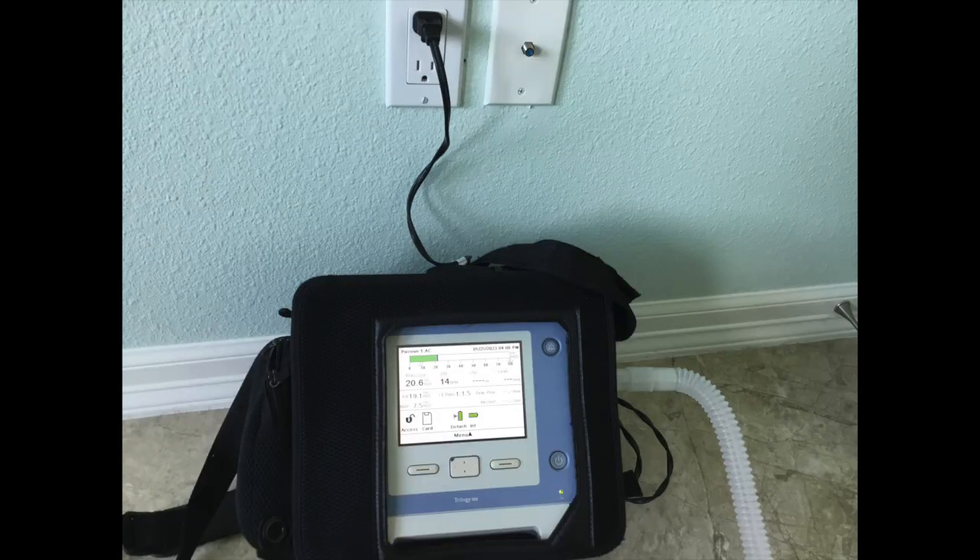When preparing to leave the house, the very first thing I do is plug in my ventilator and charge the batteries on my ventilator. I want to make sure my batteries are fully charged before leaving home.